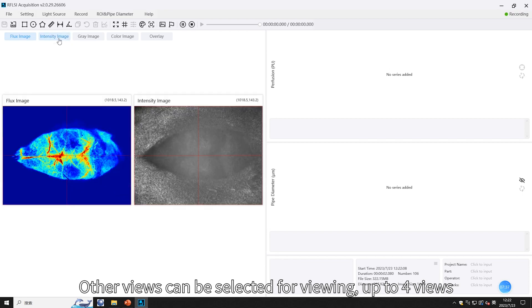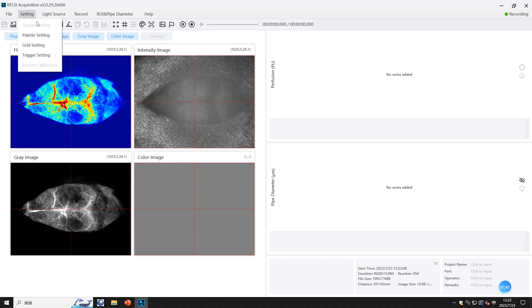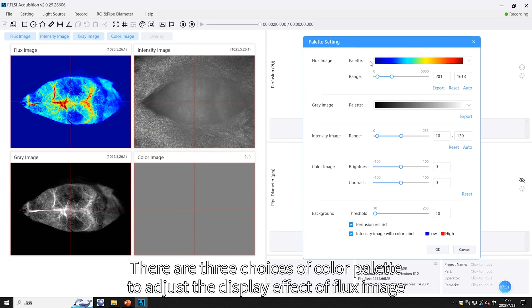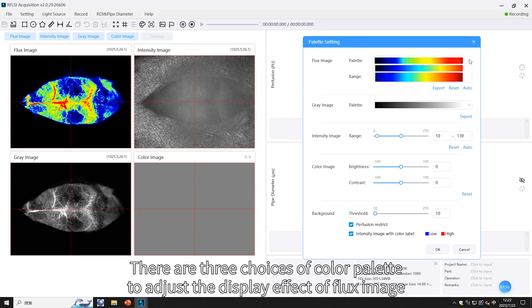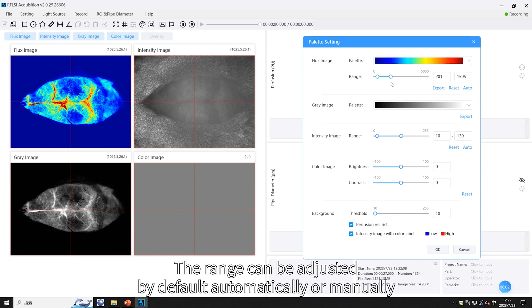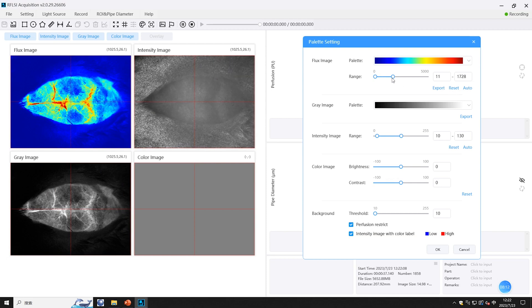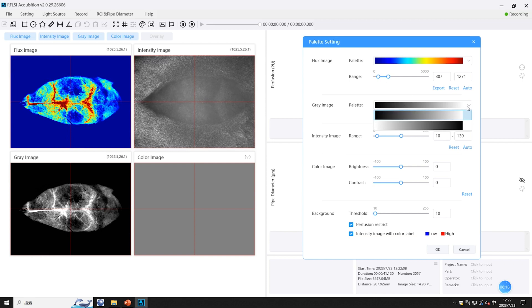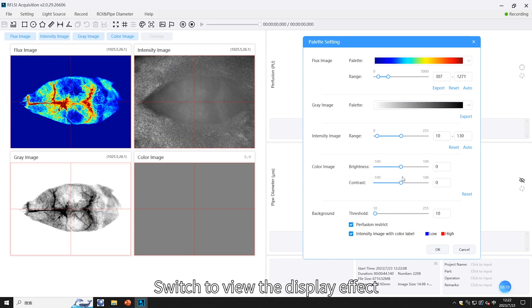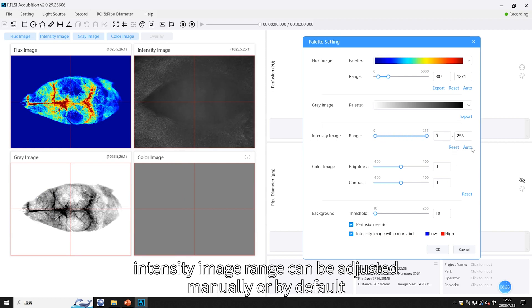Other views can be selected for viewing; up to four views are available. Click on Settings > Palette Settings. There are three choices of color palette to adjust the display effect of the flux image, and the third one is usually chosen. The range can be adjusted automatically by default or manually. There are also two choices of gray image; switch to view the intensity image, whose range can be adjusted manually, by default, or by auto adjustment.